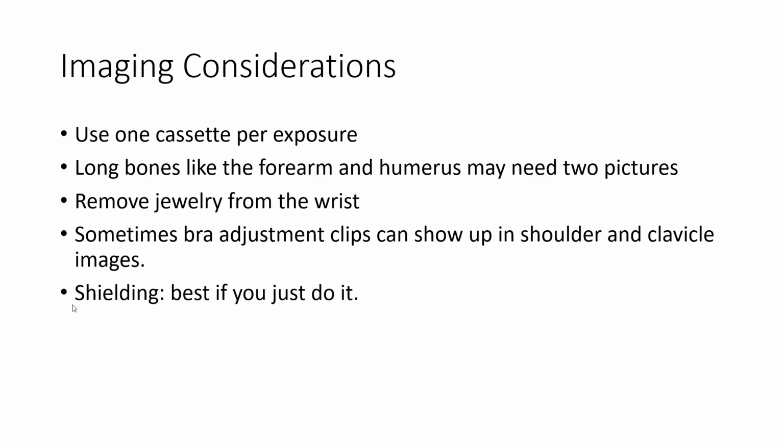And then shielding, you can shield center mass if you're looking just at the shoulder or the arm or the fingers. So it's better to just do it. It makes the patient feel better. It can potentially reduce the radiation dose. There's some controversy about shielding right now in this profession, but until there's anything concrete about not continuing to shield, if you can, you should, is kind of how that goes.